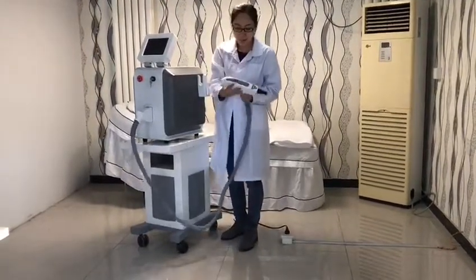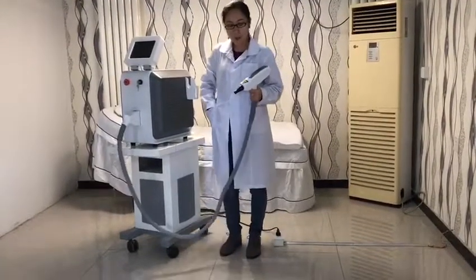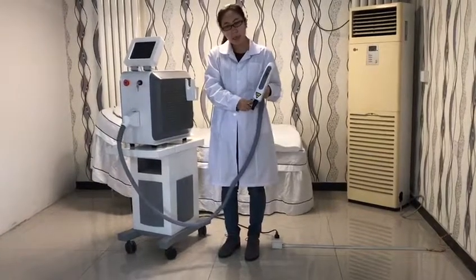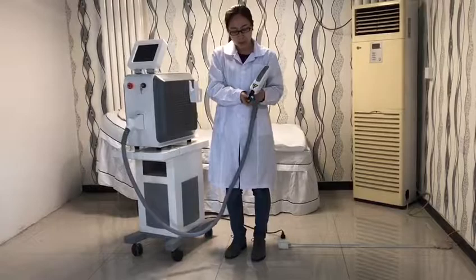Here is the counter and we offer three treatment heads. This one is for skin rejuvenation and these two are for tattoo removal.